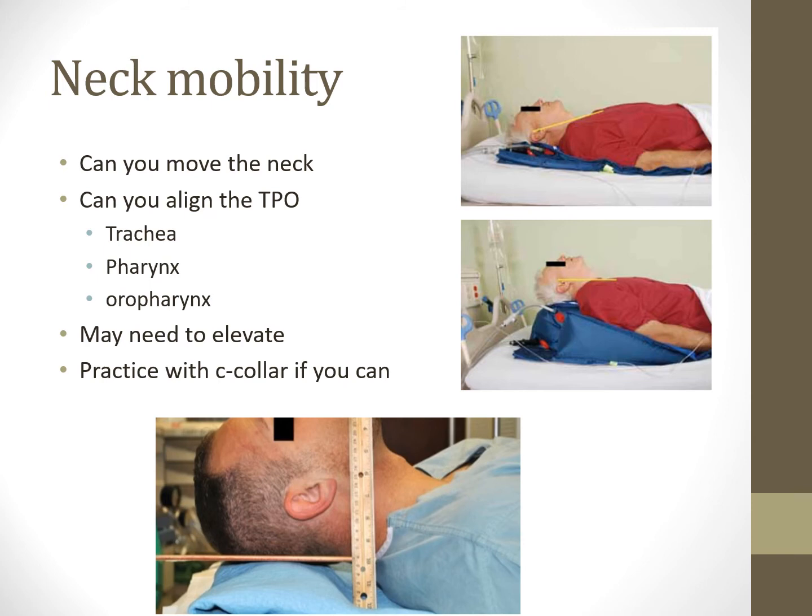Neck mobility is going to be a big one here. Ideally, in a perfect situation for an adult, you always want to, and hopefully you see this line here, you always want to line up the opening of the ear with the sternum. You don't want this slanted situation. You don't want it below the sternum. You don't want it above the sternum. You want it even with the sternum.